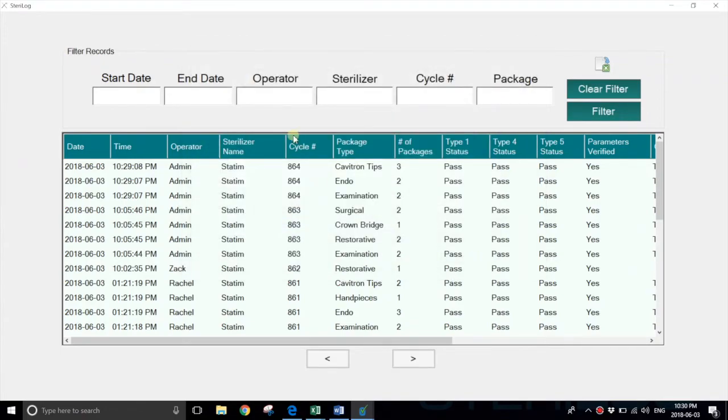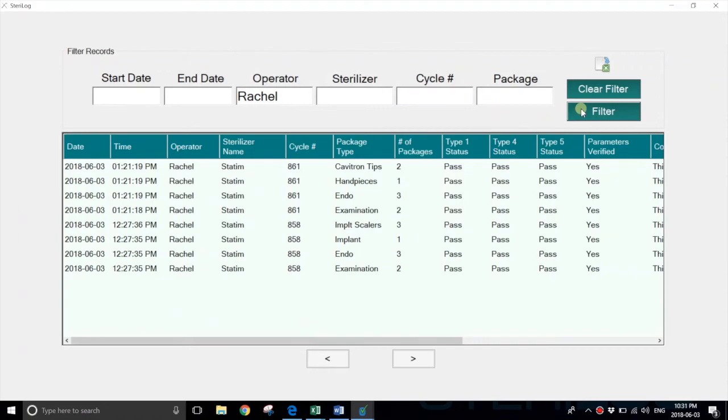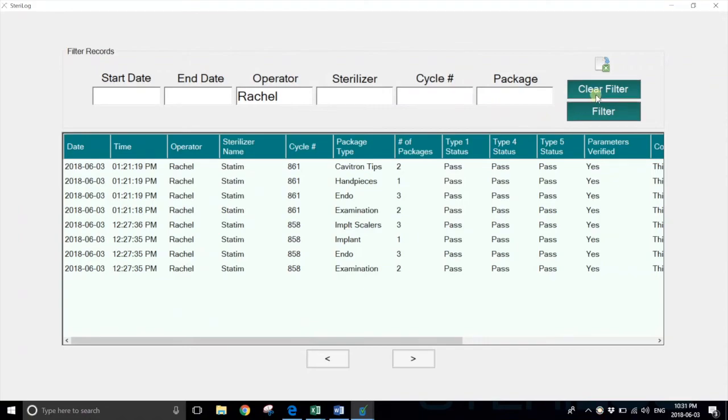You can filter on any results. If we want to see all the records by Rachel, you just key in the name and filter.